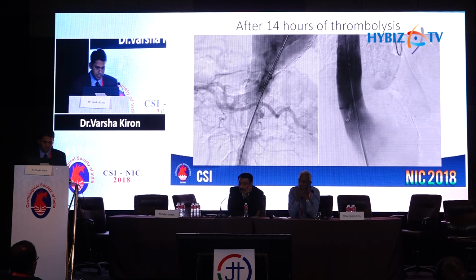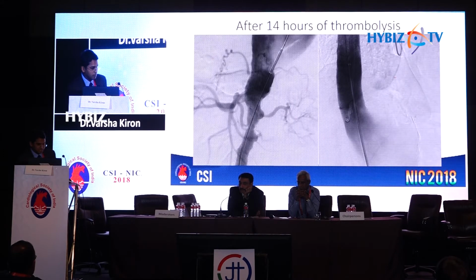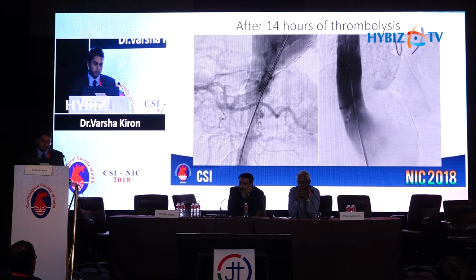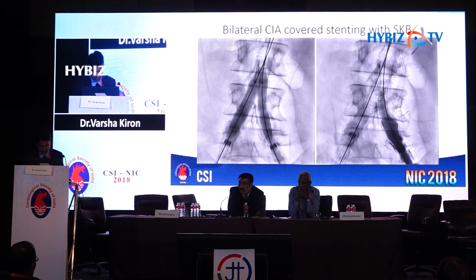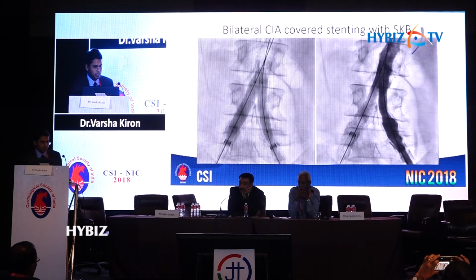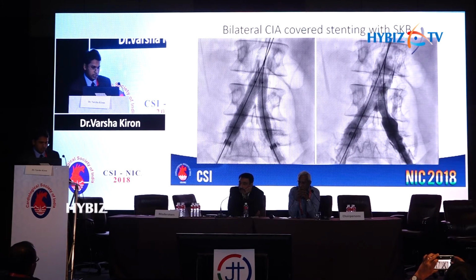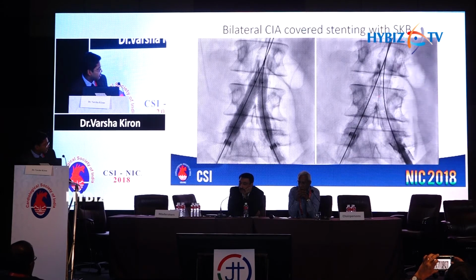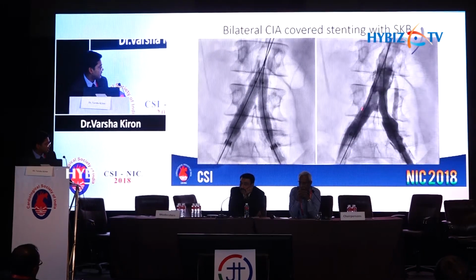The two advantages of this are that it is an over-the-wire 8F catheter, which enables us to perform angiographies, and the presence of the stiff wire while taking the angiogram gives us a working view. So we take an angiogram and immediately on the same wire we go ahead and deploy our endograft. But I have mentioned before the severely diseased iliacs bilaterally. To take care of the access, we initially started off with stenting the bilateral common iliacs. We used 8 mm balloon-expandable stents, and at the time of post-dilatation, we used a slightly larger balloon on the right side because that is the side we are taking our main endograft from.